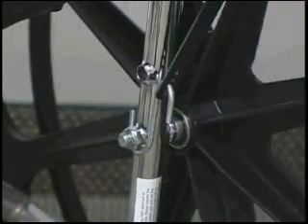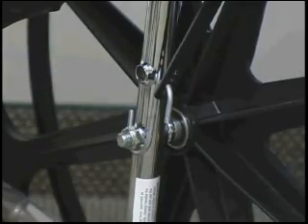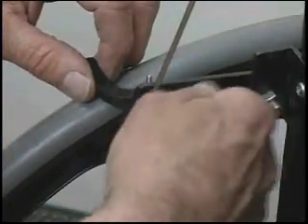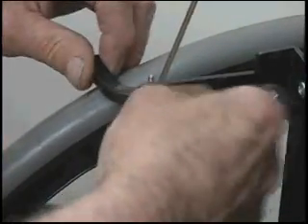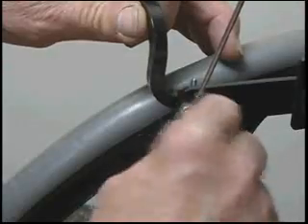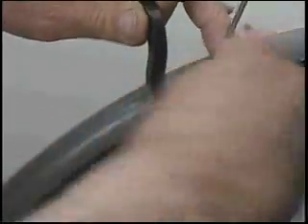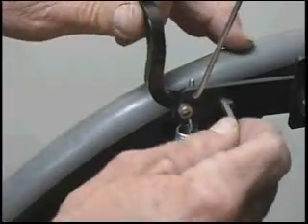When switching a wheelchair from standard to hemi height, the brake system is adjusted by simply releasing the spring tension by unhooking the spring tension anchor hook. Remove the two set screws using a hex wrench, and replace the standard height brake shoe with the hemi height brake shoe. Finger tighten the set screws and then snug them with the hex wrench.